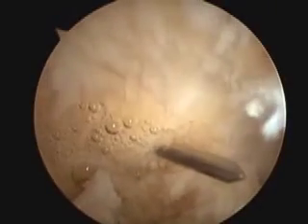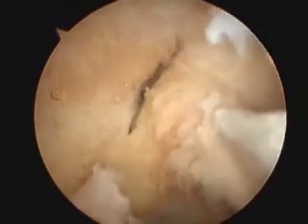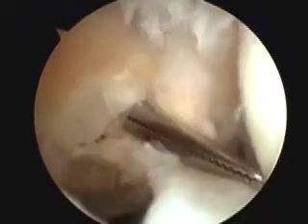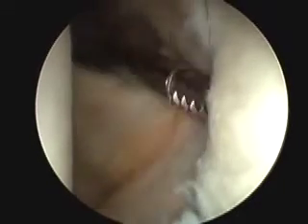With a spinal needle we established a good position for an anterior superlateral portal, then very delicately entered with an eleven blade and opened the capsule to introduce the second cannula. We used a Wissinger device to finalize placement of the second cannula. With the second cannula in place, we started to debride and create a bony bed in the very anterior part of the glenoid to fix the labrum and the Bankart with the SLAP lesion, exactly as we do in standard Bankart repairs.